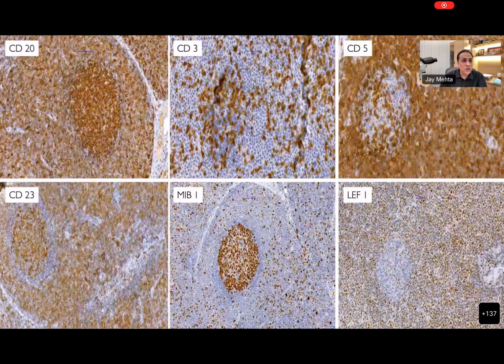This is the immunohistochemistry. What you're seeing is this residual germinal center, which is darkly staining with CD20. Now, typically, CD20 has a very dim expression in CLL, SLL cells. So you can make out here the difference in reaction. It's very bright here, and relative to this, it's dim. CD3, which is a T cell marker, is negative in the lesional cells.